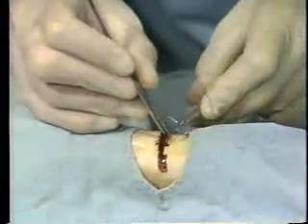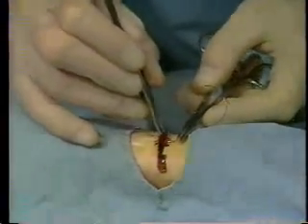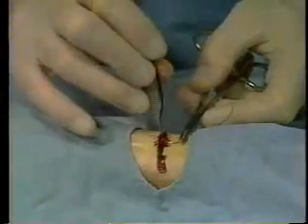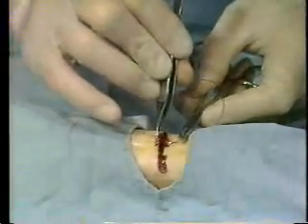Puncture the uppermost layer of the skin 1/8 of an inch from the incision edge. Use the forceps to separate the layers of skin so the needle tip will be exposed. You need to visualize the needle tip to prevent it from entering the dermis.